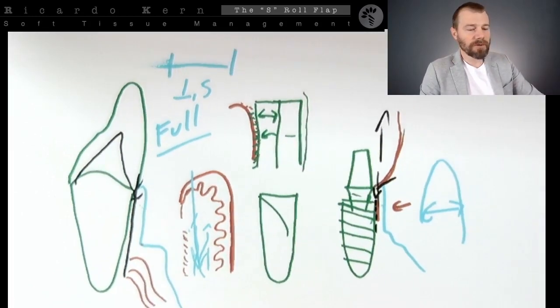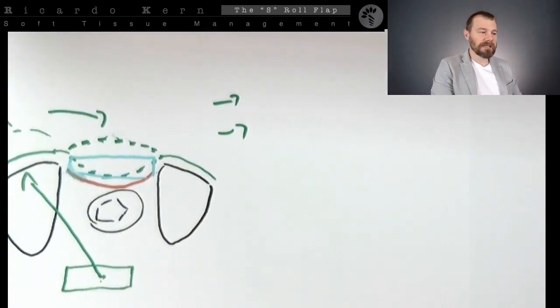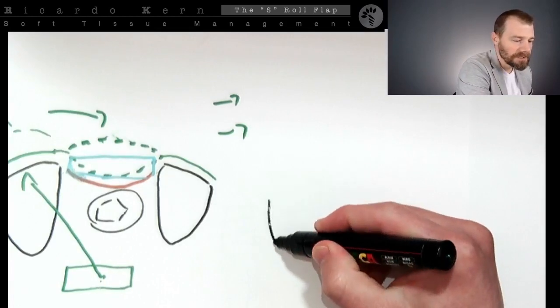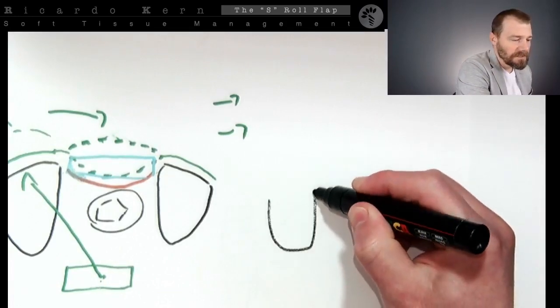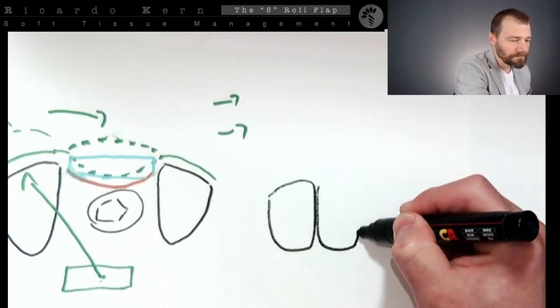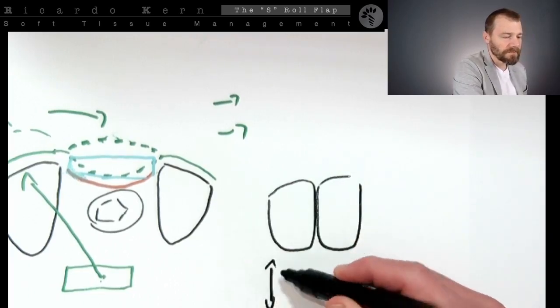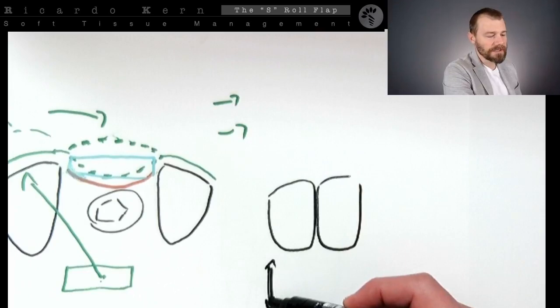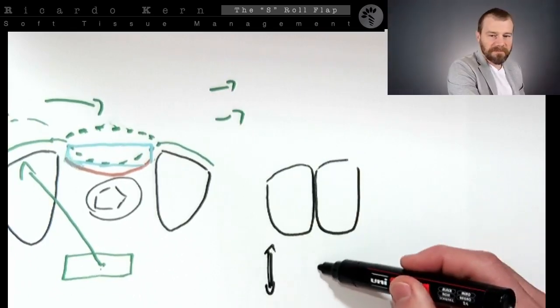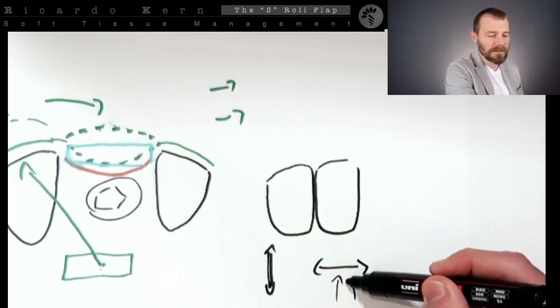That's right. So if you do not have the chance to remove the crown over implant or over natural, you can have an alternative access to this area, that is through a vista incision. So vista incision is going to be a lateral incision in vertical direction. So coronal apical incision, never this way. Oh, sorry, never this way here. Why is that? Because here you're going to compromise a lot the blood flow.